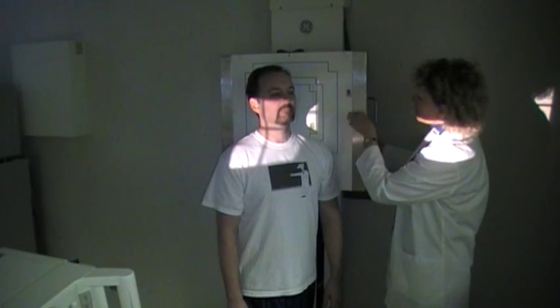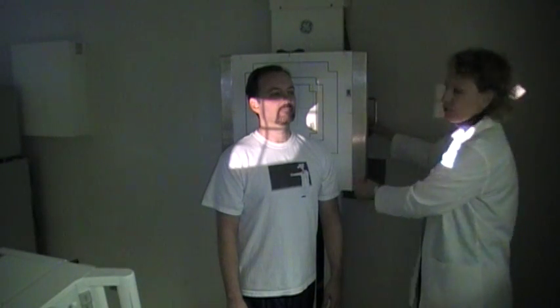David's pointing it out for you. And then adjust your bucky tray so that it is centered with your central ray. Okay, since his left shoulder is touching, this is the left AP oblique of the cervical, and my left marker is already up there from that left lateral, so we don't have to change that.